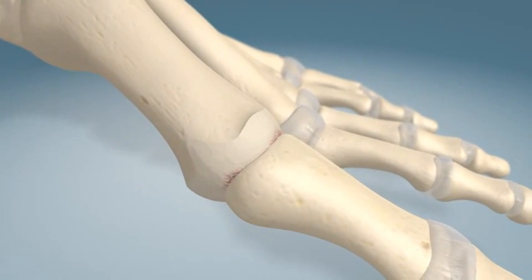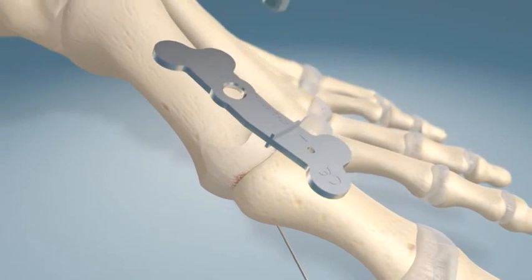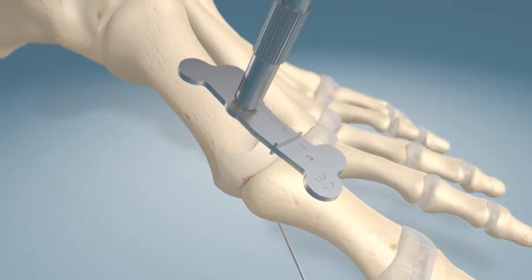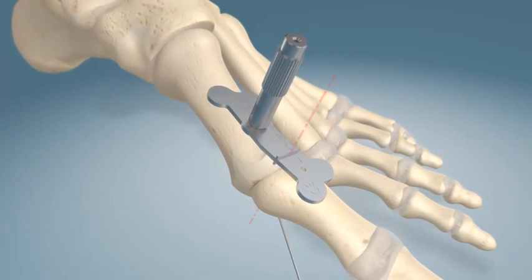A guide wire can be used as temporary fixation. A locking wire guide is screwed into the template and can act as a joystick to help position the plate on the toe over the first MTP joint. Once positioned, a 1.2 millimeter guide wire is placed through the hole and into the metatarsal.